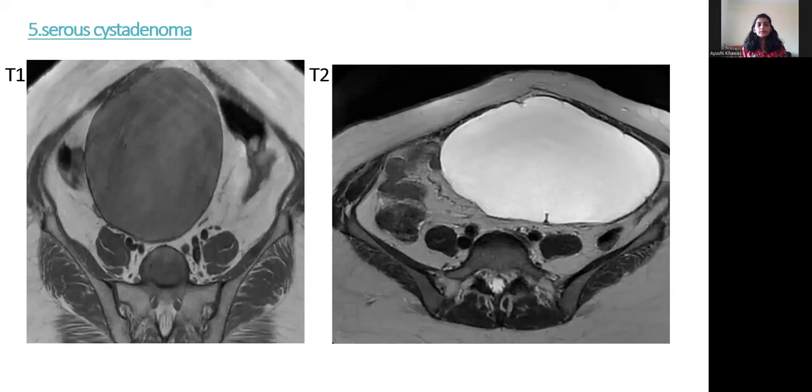Fifth case: serous cystadenoma. On T1, it is hypointense. On T2, it is hyperintense.